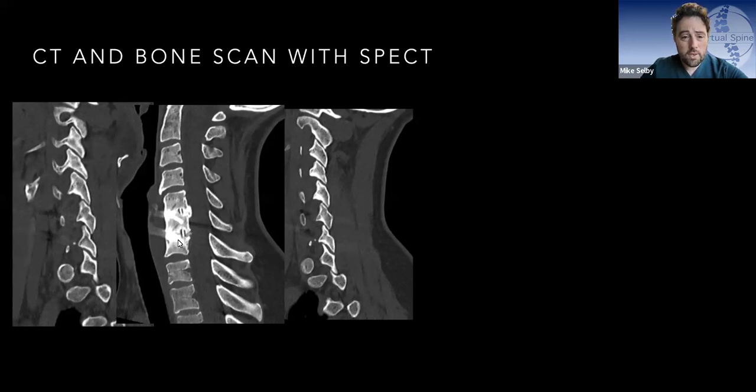You can see here in the central part that there appears to be some bone growth through the middle of the cage, but there's also this sort of weird heterotopic bone at the back here, which again, to me, can be a sign of non-union. You can see a little gap there, a little gap there. So this is a concerning CT for me, but you'll often see these reported as fused by the radiologist.